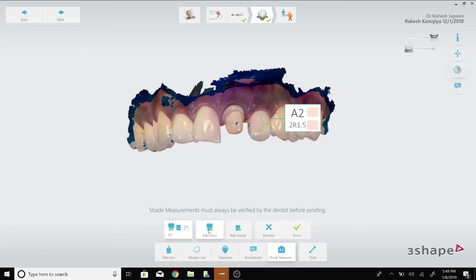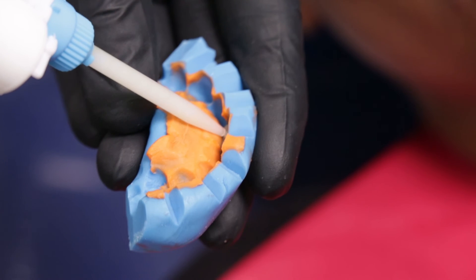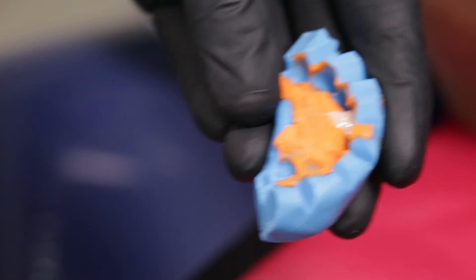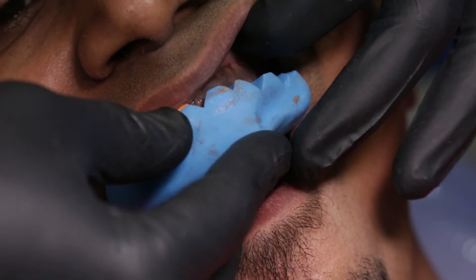Since it is an anterior tooth, the patient's shade can be visualized easily on the Trios 3 software, making it very easy for the technician in the lab. I use the putty index which I had made on the printed mock-up and give a provisional restoration to the patient before discharging him.